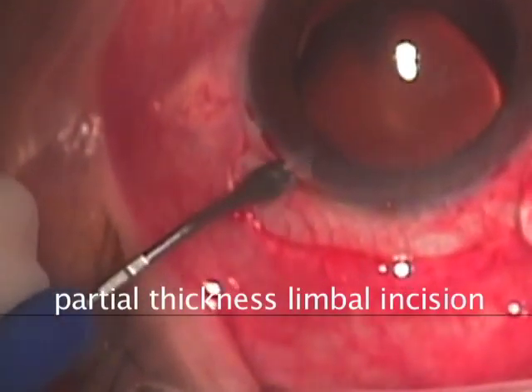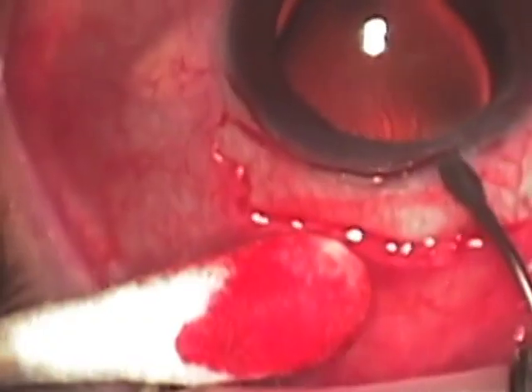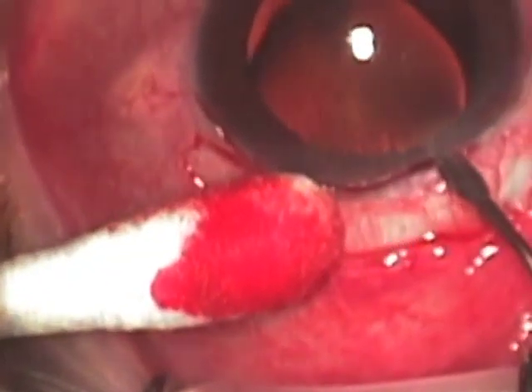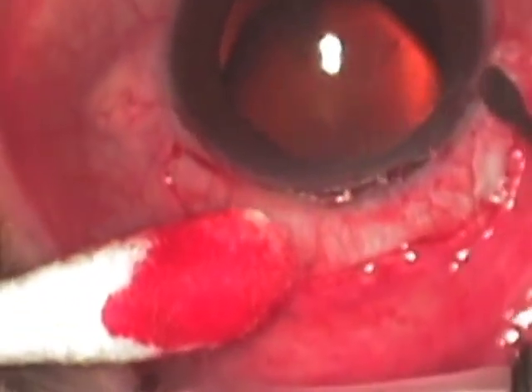Next, a partial thickness incision is made at the limbus superiorly to about 50% thickness. This allows a two-plane incision that will next enter the anterior chamber as we use a keratome blade.